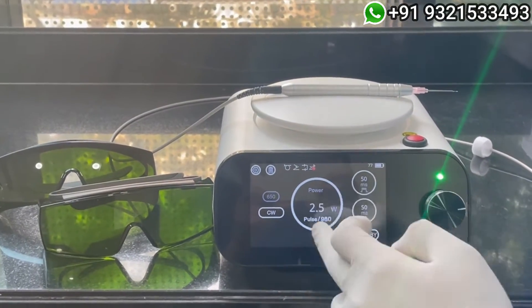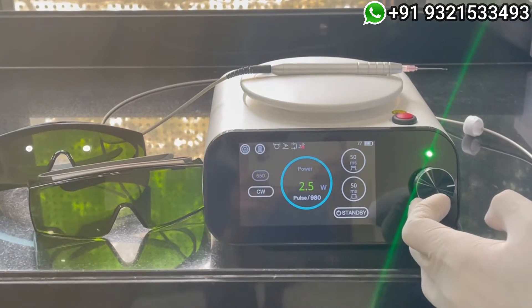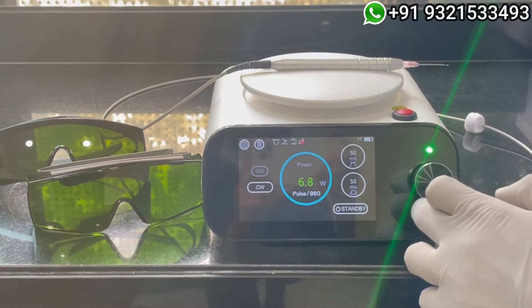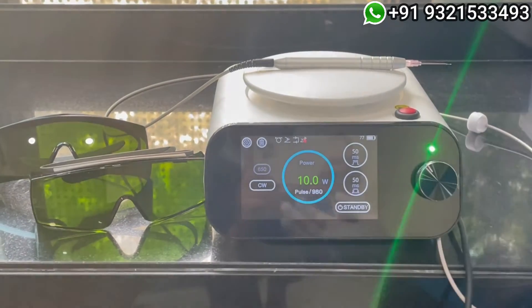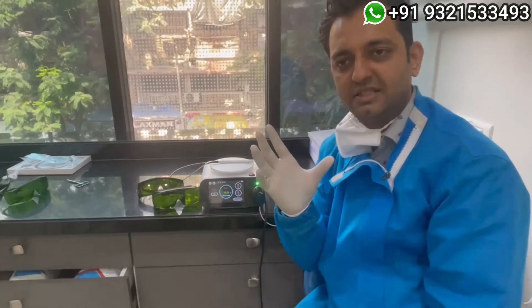Depending on the case — today I am going to operate on oral submucous fibrosis — I can change the wattage and go up to 10 watts. This is one of the very good machines for all laser operations.